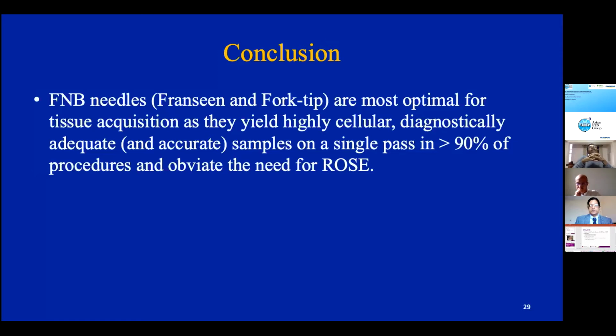If you ask me what the physiology and the physics behind it are, we really don't know. But we feel that you retract the stylet, and you don't have to do it all the way. You just perform your 4 by 4 passes through different quadrants, and by then the stylet will be halfway out of the needle, and then you can discontinue the procedure, and eventually you should have enough tissue. With histological needles, you don't have to worry about specimen bloodiness. Specimen bloodiness does not bother pathologists when you process the specimen as an FNB sample. Only for FNA, when you have a lot of blood, does the pathologist have a problem.